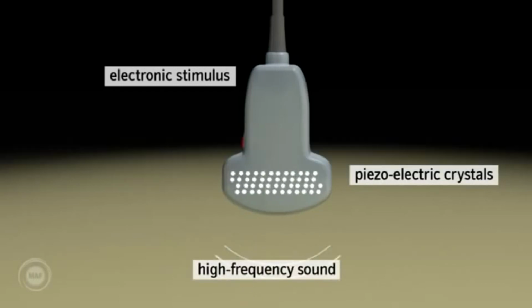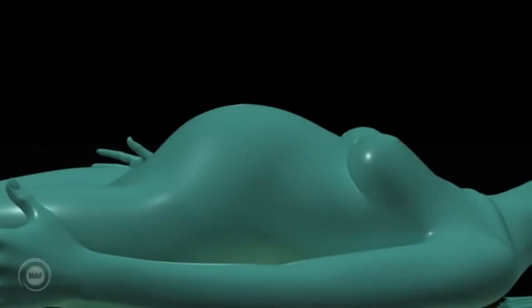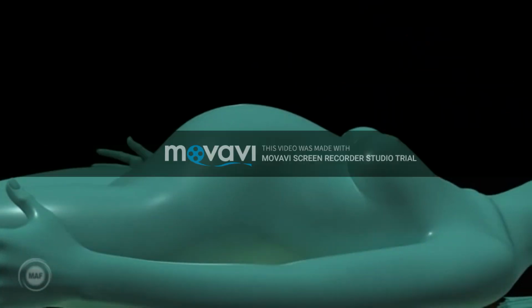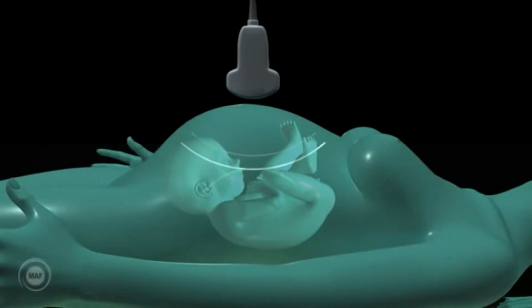sound is emitted. The sound wave then travels through different tissues in the body, which have a different penetrability, also known as acoustic impedance. So part of the sound energy is reflected by the tissues, and part continues to travel through until it hits other tissues and is reflected back.